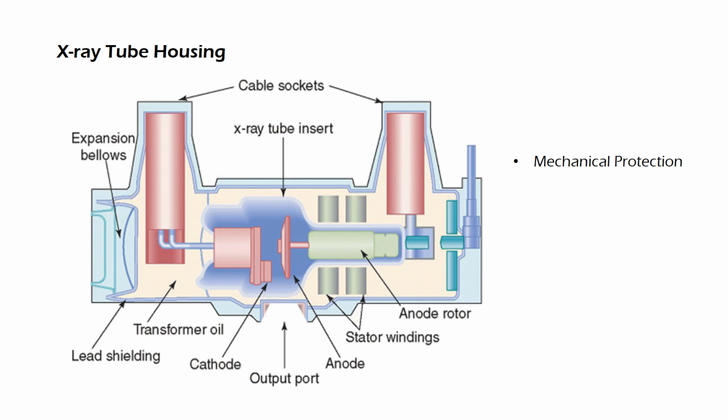The change of the oil volume with varying temperature is taken care of by the expansion bellows. The oil carries the heat away to the housing by convection, sometimes enhanced by forced cooling with a ventilator or heat exchangers.